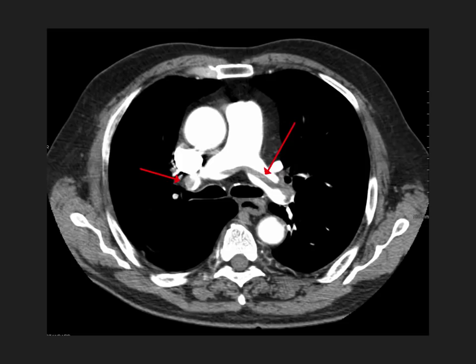Here's our first abnormal CT. You see the arrow pointing to something — what's going on here? Pause the video if you need more time. What we're seeing here is a pulmonary embolus, specifically a saddle embolus. It's called a saddle embolus because it kind of saddles itself over the pulmonary vasculature right at the bifurcation of the pulmonary vessels.